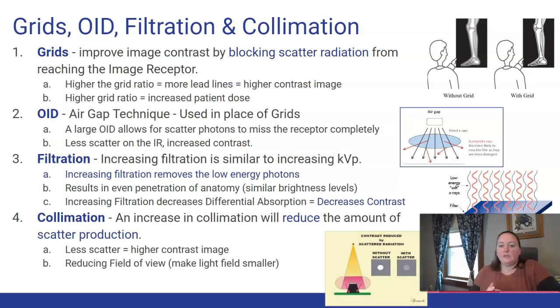Filtration. Increasing filtration is similar. It's a similar concept to increasing kVp, for me to remember that, right? Do we as technologists adjust filtration? No, we don't. But increasing filtration removes more of the low energy photons.